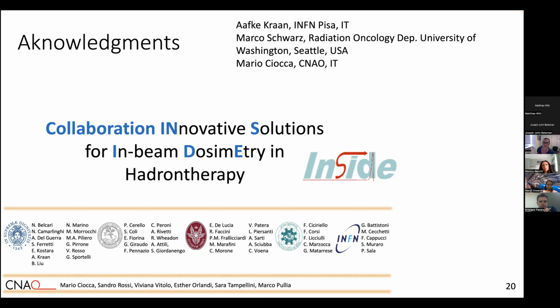Yeah, okay. I think that cone-beam CT is the most advanced and the most versatile, as I said, where there can be more room, for instance, for therapy adaptation, the one that I call the dose of the day. And for range monitoring, I think that in-room functional PET imaging, with the possibility to acquire a larger field of view, with faster and top-grade electronics that can also acquire the short-living beta-plus emitters, can really be an upgrade for range monitoring.